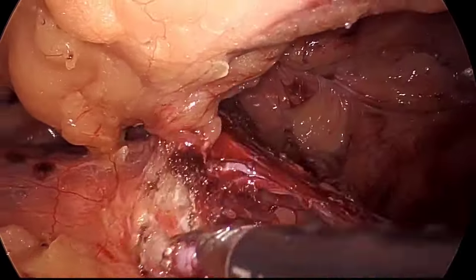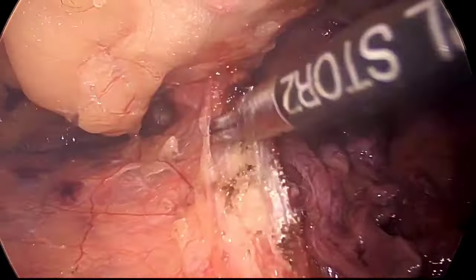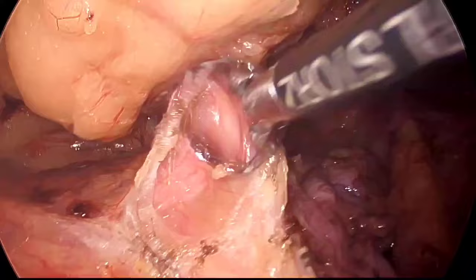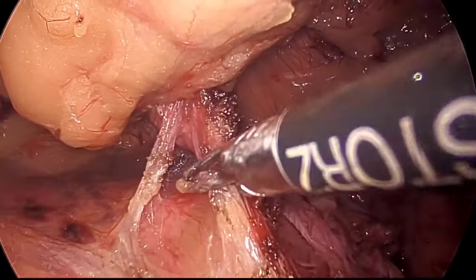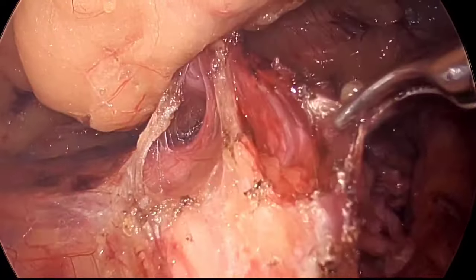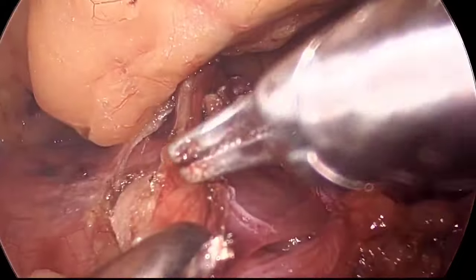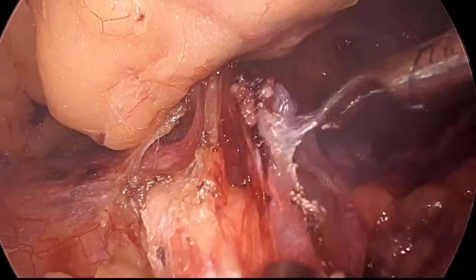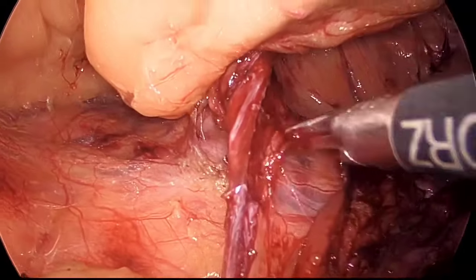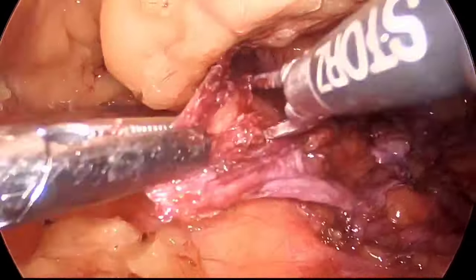You will feel there is external pull because of the pneumo pressure, but a good amount of traction from inside. You can also ask your scrub nurse to put pressure from the outside, so that you can manipulate the sac nicely. If needed, you can put one extra port for assistant traction of the sac, so that you can divide the sac nicely. In this case I didn't use the extra port at this point of time.